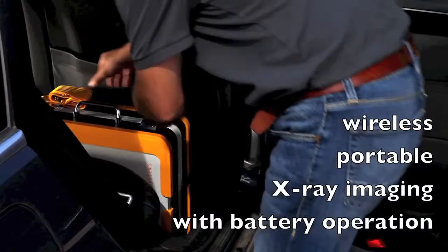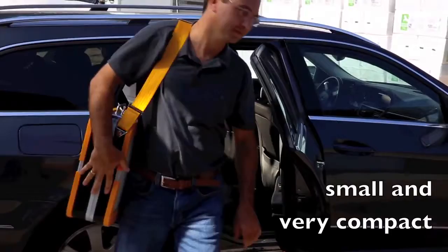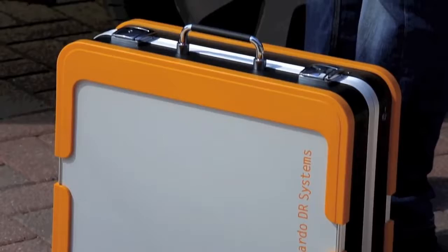The Leonardo Mini Suitcase is the ideal daily companion for any situation requiring a portable digital x-ray system. It is currently the smallest and lightest DR system on the global market. The suitcase is easy to transport even for female veterinarians.